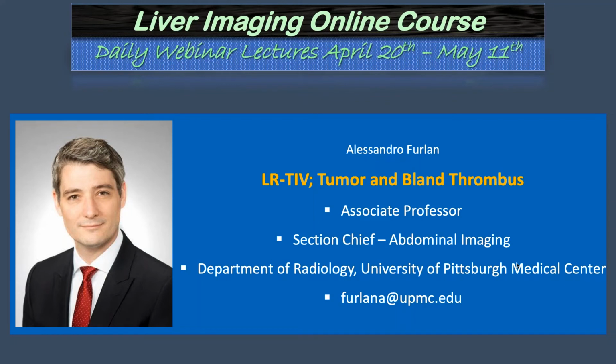If you have no enhancement in a tumor thrombus because the tumor is mainly necrotic, then it can definitely mimic a bland thrombus, especially if you have only a one time shot, one study at one time, and you don't see the evolution over time. So it can definitely mimic, yes.